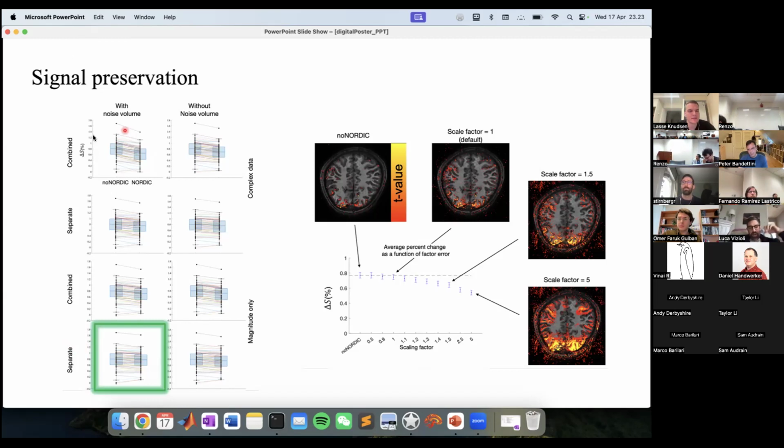You're absolutely right about the threshold. The SVT is basically determining how aggressive you are on your singular value thresholding. So yeah, I never thought about the rank, but it sounds interesting. I think about it a little bit more. Another thing that we're thinking about as well, relative to the limited number of components, we're trying to work on it right now, but I'm not sure.